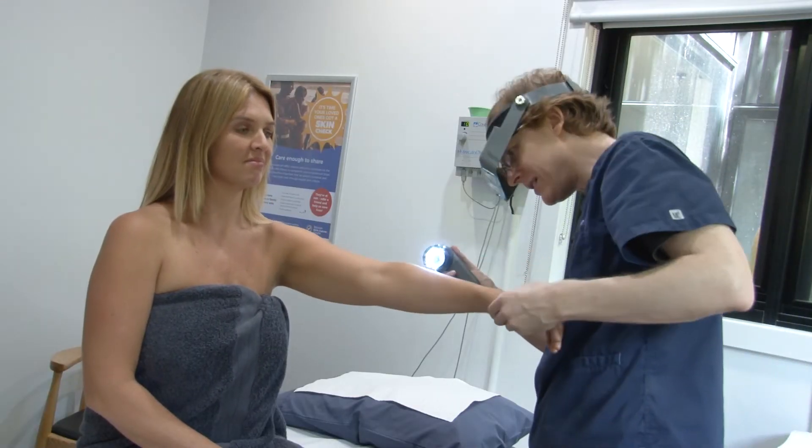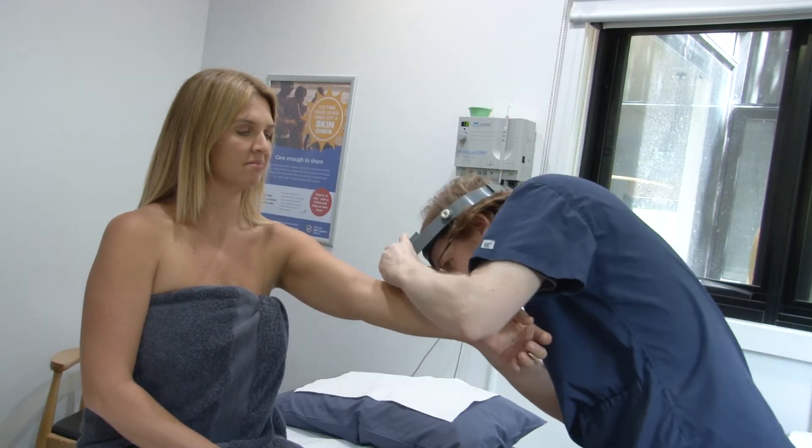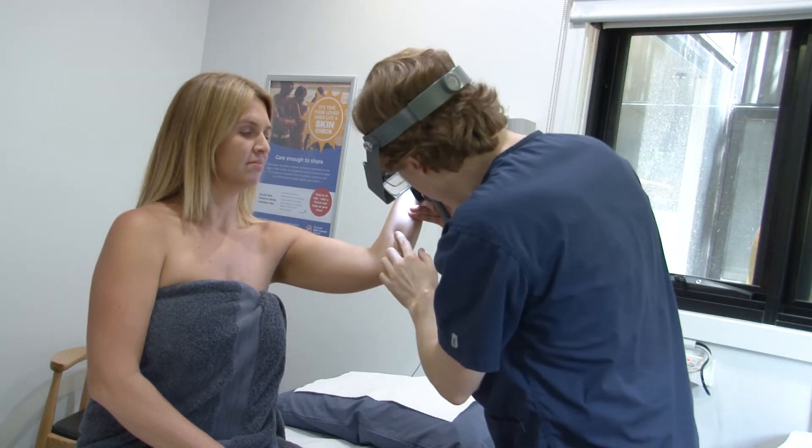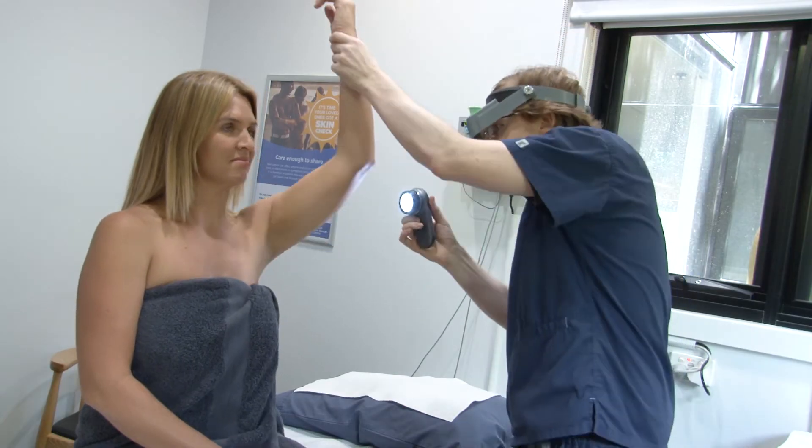Your forearm's in quite nice nick. You've got a bit of background freckling, the occasional mole probably worth having a quick glance at — just a little burn or something from the past. Your head, your neck and your arms — no skin cancers there. Most skin cancers are probably in sun exposed areas and you don't seem to have any. Let me just check the rest.